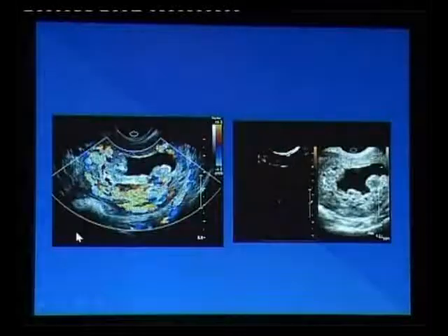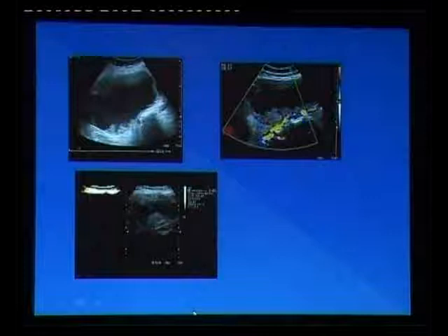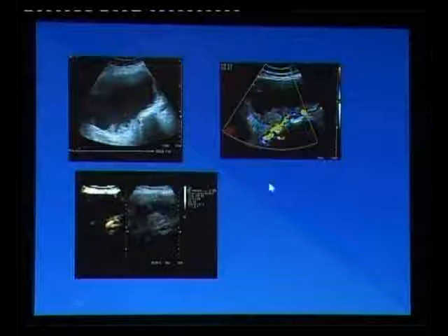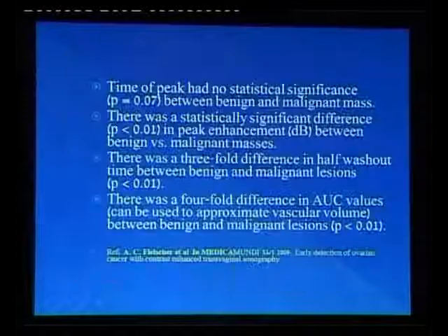And we have 2 or 3 cases where we had multiple papillary projections markedly enhancing on contrast. This was a malignancy. We had one more patient where we had small papillary projections, but they showed a lot of enhancement on contrast. This was again a borderline tumor which was operated upon at a hospital.